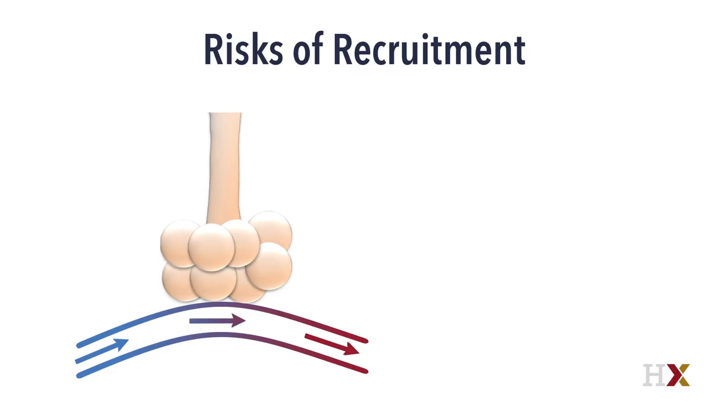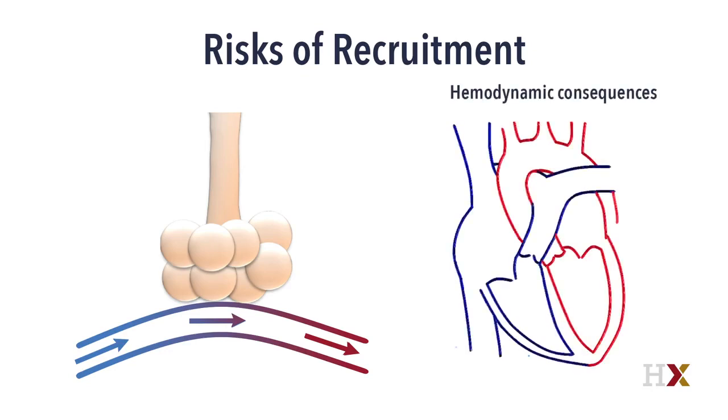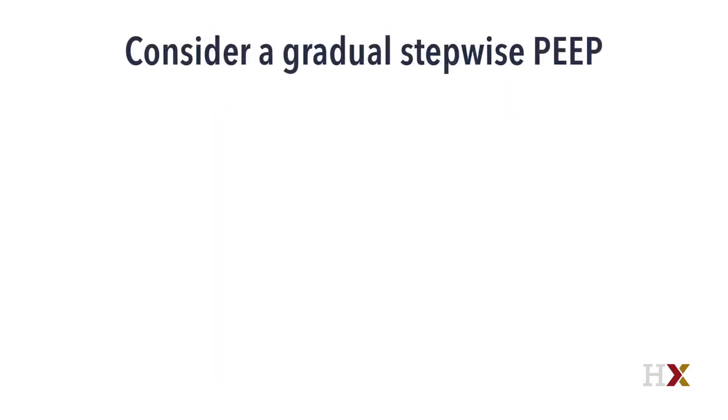of pressure. The more concerning finding is that a patient who has some right ventricular dysfunction at baseline, or especially in light of the ARDS, may be particularly susceptible to hemodynamic consequences with a recruitment maneuver. The increasing pressure in the intrathoracic system can lead to decrease in venous return, and increase in pulmonary vascular resistance, and acute right heart failure and decompensation. This is why we recommend instead a more judicious approach to increasing the PEEP.